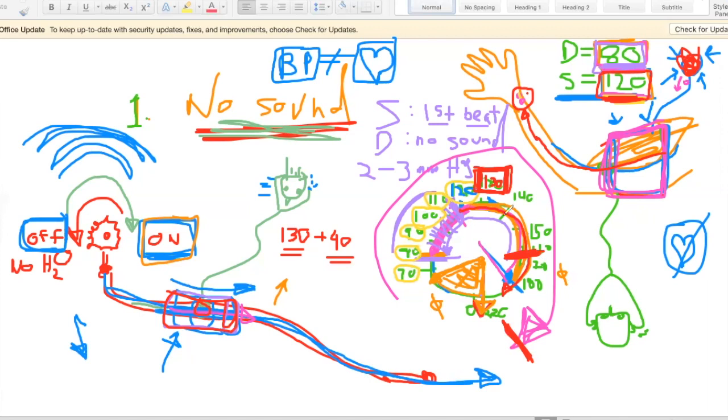And then when you reduce the air at about the estimate of their systolic blood pressure, you'll start hearing the beat, and then the beat, and then the beat. There's more air leaving, and eventually I don't hear anything anymore. When I first hear the beat is going to be my systolic blood pressure. And when I don't hear anything anymore, it's going to be my diastolic blood pressure. Those are the values that you're going to mark on your systolic and diastolic blood pressure. Again, you would take 3 measurements and take the average.